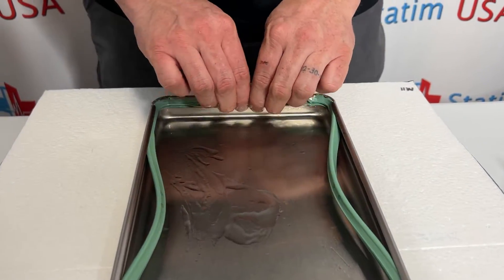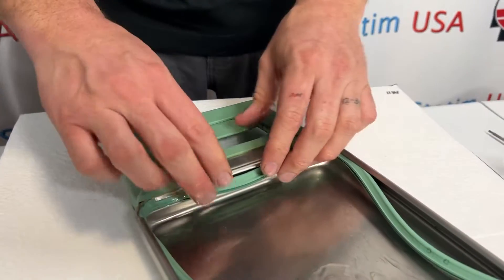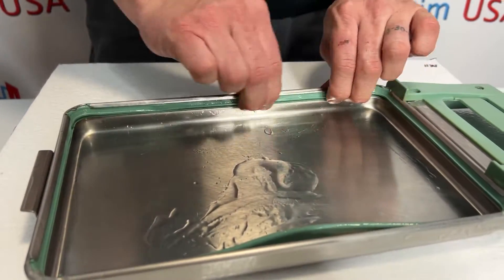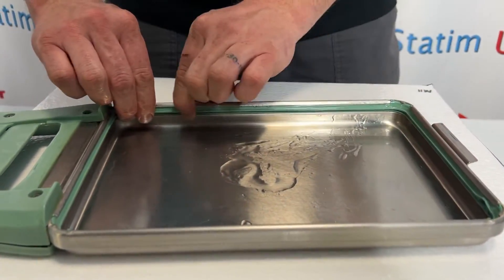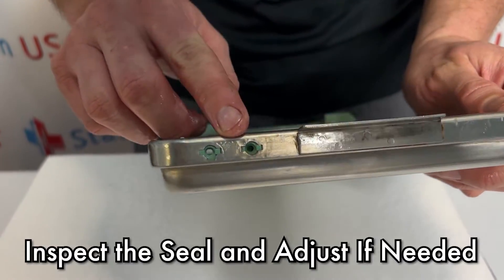I'm going to start on the back, press this into place, and then go to the front and do the same. Once that seal is in, you want to look at the back — we are off just by a little bit.